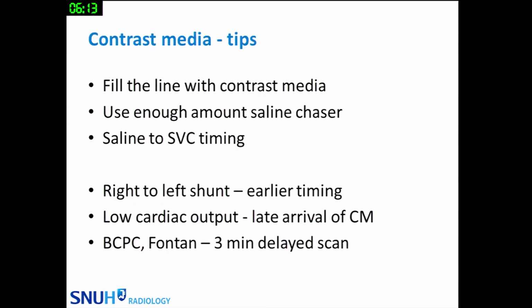This is a small tip when you have to do a CT scan by yourselves. The contrast media is very important. The machine is very nice and everything is just a single touch. But the contrast media protocol and its preparation are very essential for cardiovascular imaging. And these are tips for successful imaging of the heart. Fill the line with contrast media because the patient is small.